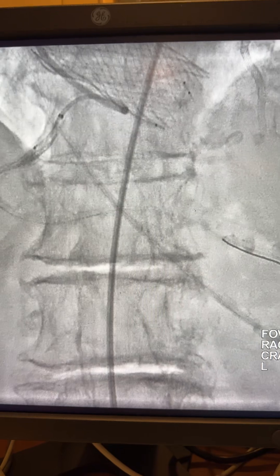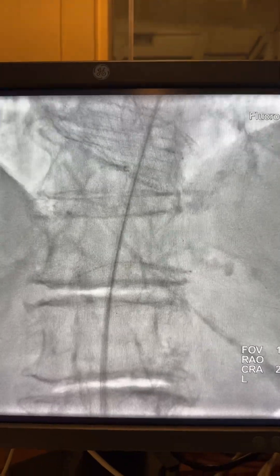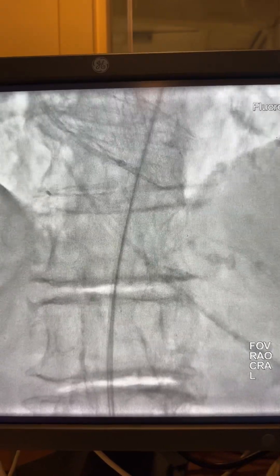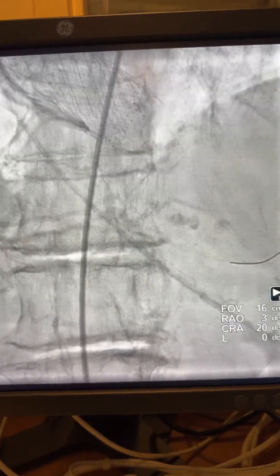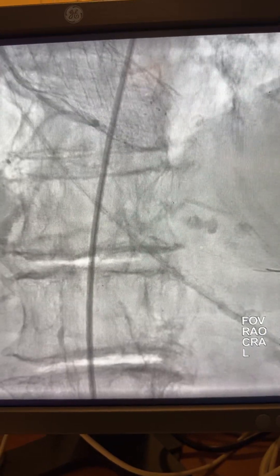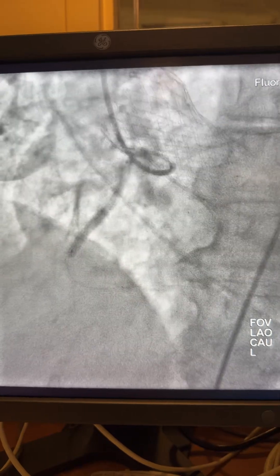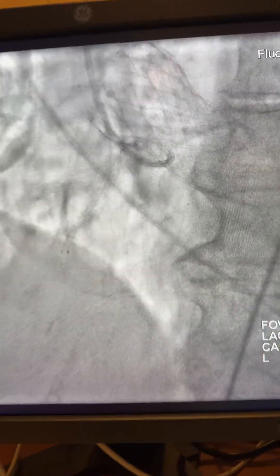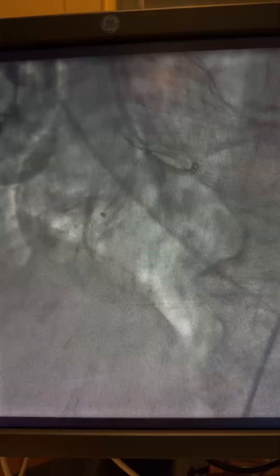You can see where you're going to intervene — on the PDA and the RCA — and you continue the intervention. Here I have to balloon the PDA using a 2.25 balloon, then intervene on the RCA. Here the stent result in the RCA is 3.0. Again, before you pull the balloon, you withdraw with the guideliner. And here is the final result.